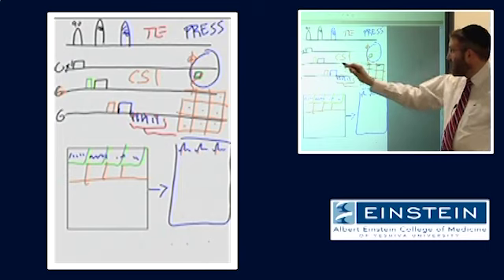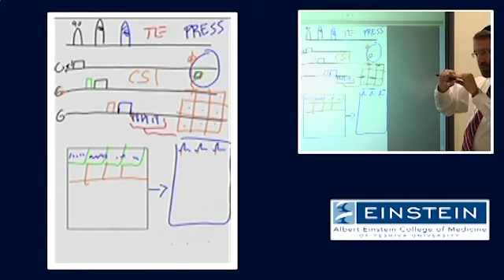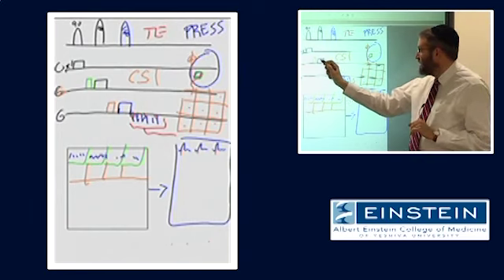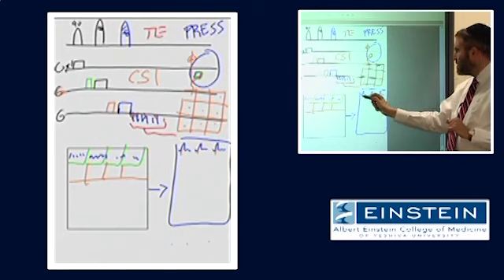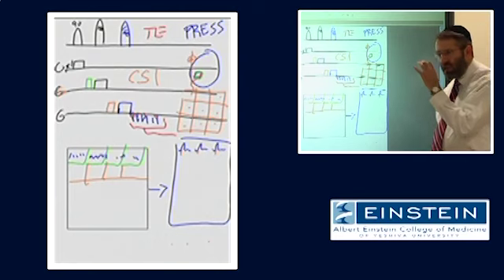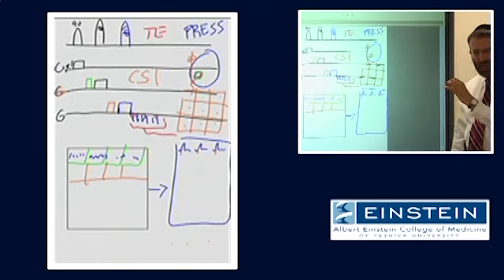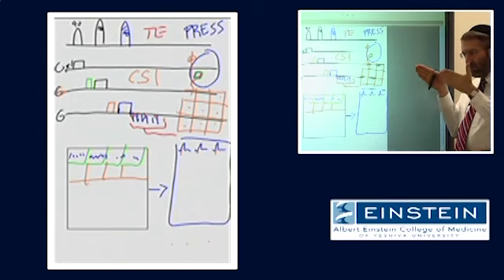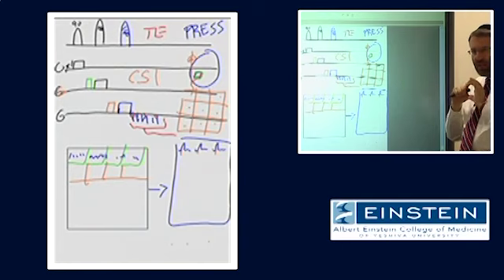It's a way where we can select a slab of tissue, and we can separately iterate this again and again to spatially encode those spectra. And instead of only looking at a single location at a time, we can actually end up looking at, in a single acquisition, multiple locations within a volume of tissue.